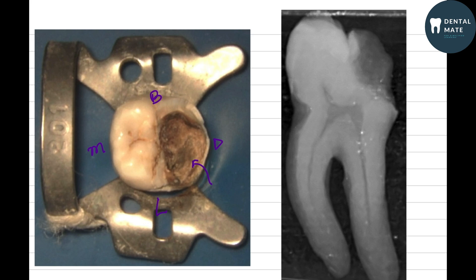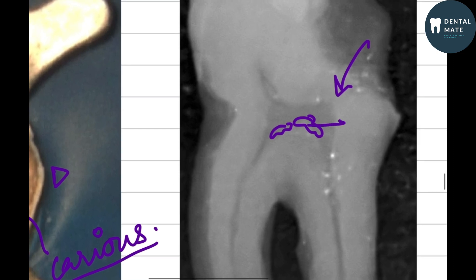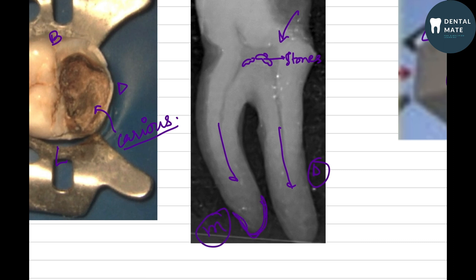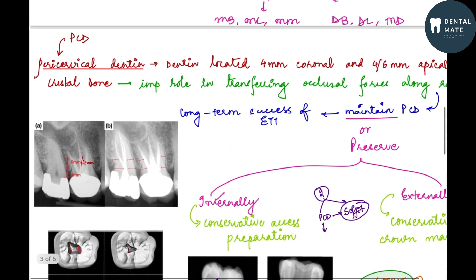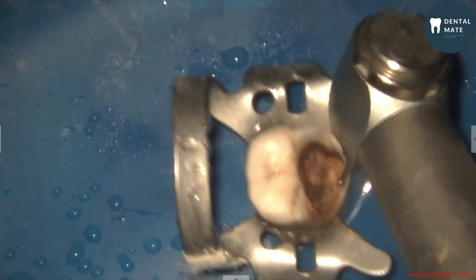This is the case we'll be discussing today. This is the mesial side, this is the distal side, the buccal side, and the lingual side. We'll be taking a carious approach for the access opening of this tooth. On radiographic evaluation, we can see a carious lesion involving the pulp, with ragged borders seen on the pulpal floor suggesting the presence of pulp stones. The roots are curved distally with a slight mesial curvature of the mesial root.